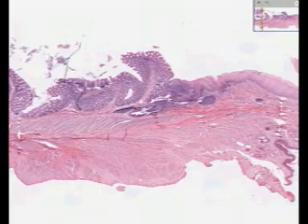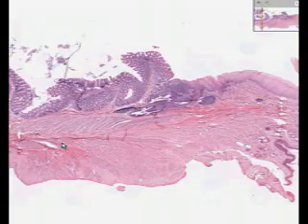There are several areas in the body where we have a transition in surface epithelium from a columnar or single cell type of mucosa into a multi-layered or stratified squamous type of mucosa. And the anal-rectal junction is one of them. I could probably think of a couple more, like the gastroesophageal junction, as well as the squamo-columnar junction of the cervix, where the ectocervix changes into the endocervix.